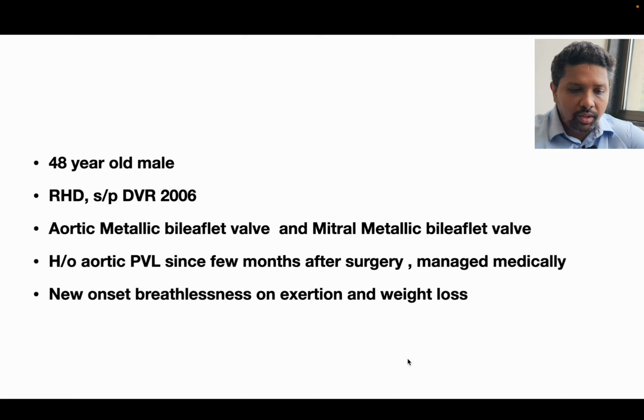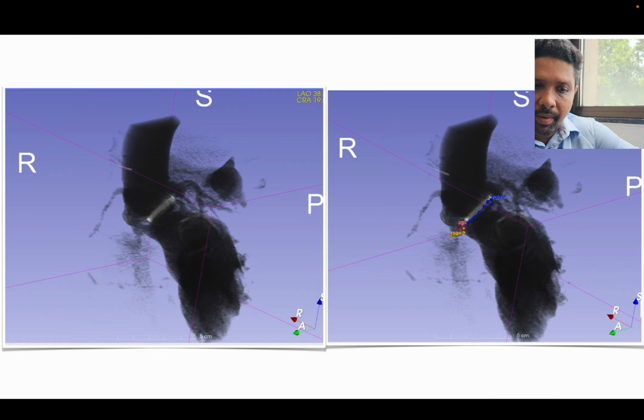RV was unusually dilated a bit, and there was an artifact coming in RVOT from LV, as you can see on this clip. And see, the leak is really severe. Now we did a CT scan, and as you know, we found rather than paravalvular leak, one more thing, a pseudoaneurysm which had ruptured into the RVOT. This is the working view that we got through CT scan.